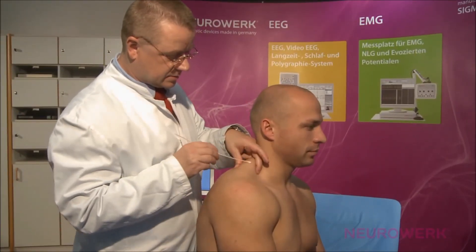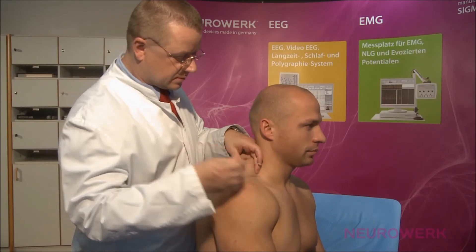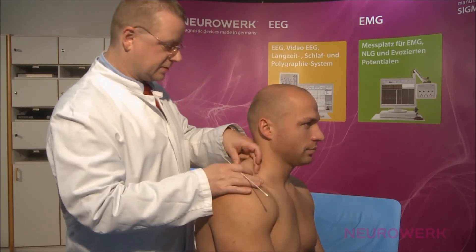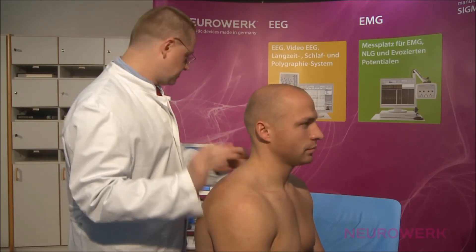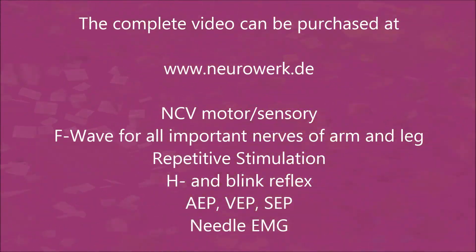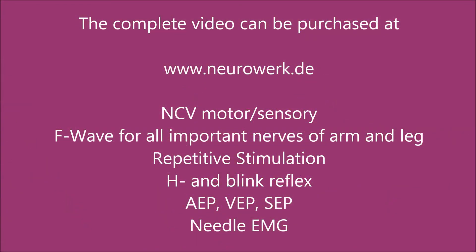The active electrode is placed directly on the trapezius muscle, which can be felt out when the patient constricts the muscle by pulling his shoulders up. That is the movement in the trapezius muscle, where you could see an effect.